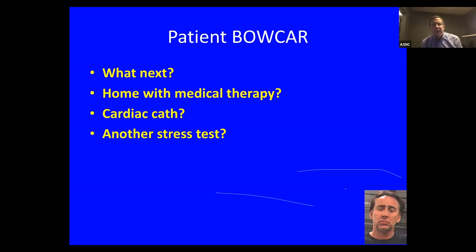It's a concerning study. And as I mentioned earlier, when you call the medical house officer or the internist or the nurse practitioner rounding, they're going to hear the static perfusion looks good, normal. And some of the other issues here may not really resonate with them. So this is a good case for us to call the attending or the cardiac fellow to tell them our concerns. And I certainly would have gone back and talked to this patient about what this chest pain feels like. Tell me more about this. He's a smoker, and so you're a little bit concerned.